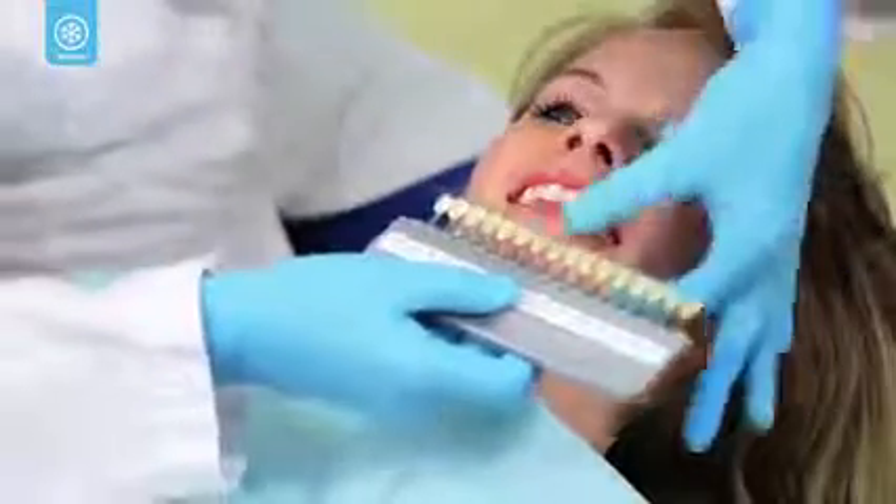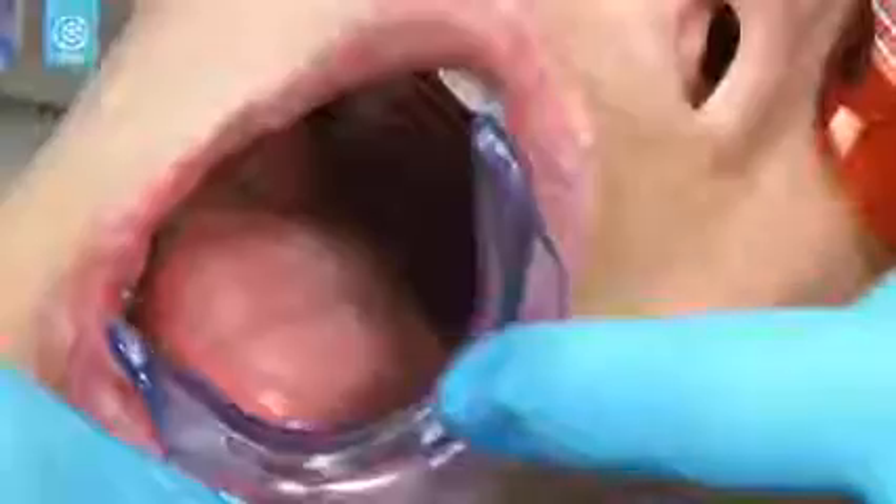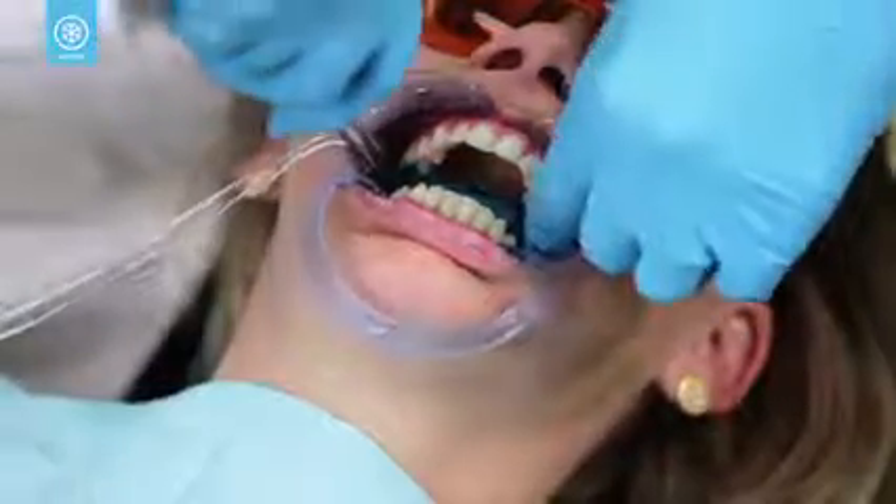To get started, your dental professional will determine the shade of your teeth with a shade guide. As a precaution, you'll wear protective eyewear during the procedure. A lip and cheek retractor will be placed in your mouth, followed by a bite block to keep your tongue and lips clear of the whitening gel.